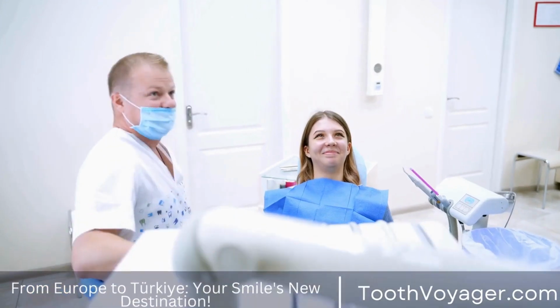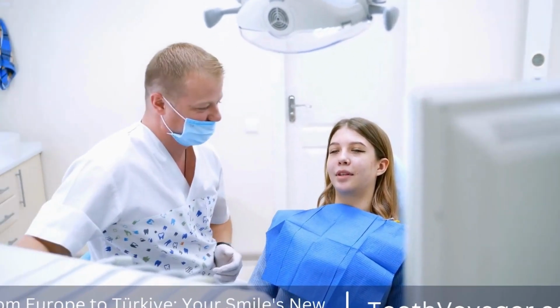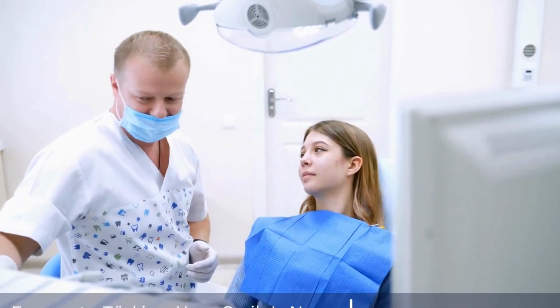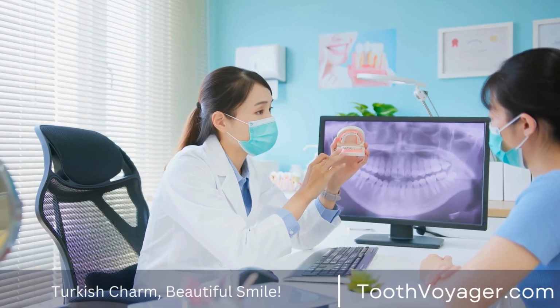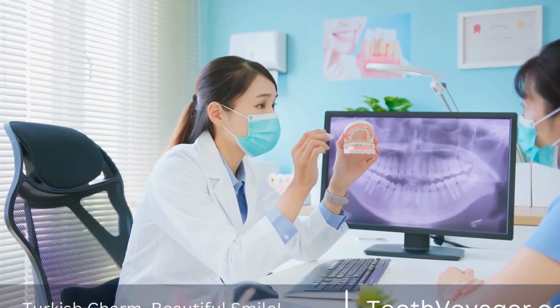Dental professionals will ensure that the crown matches the shape, color, and size of the existing teeth of the patient to create unison. The crown is made to fit the mouth of the patient perfectly and offer the best comfort and functionality.